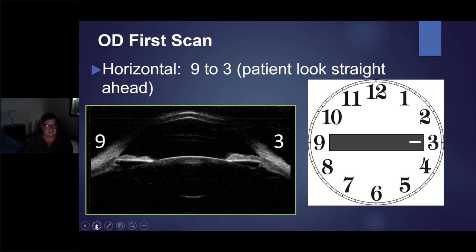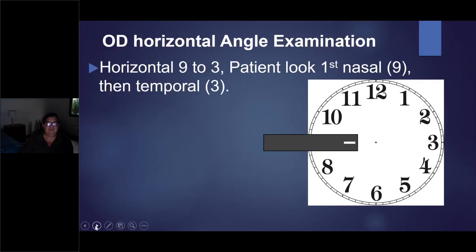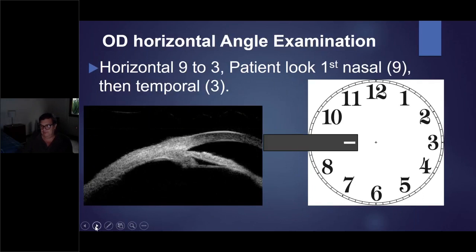I ask the patient, please look to your nose. The right eye is one direction and the left eye is another. And because he's moving his eye or her eye to nasal, it shows me the temporal angle. This is my second shot. Look first nasal, and I have 9.